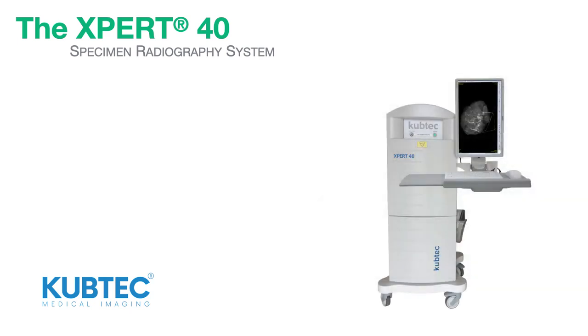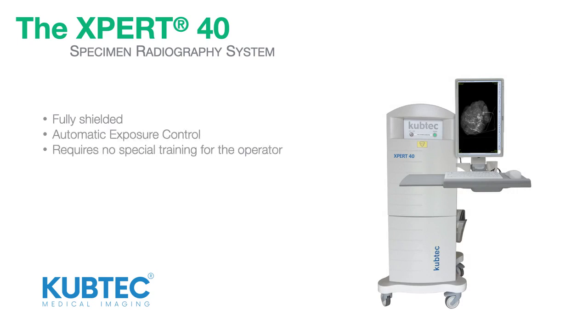The Expert40 system is fully shielded with automatic exposure control, and requires no special training for the operator.